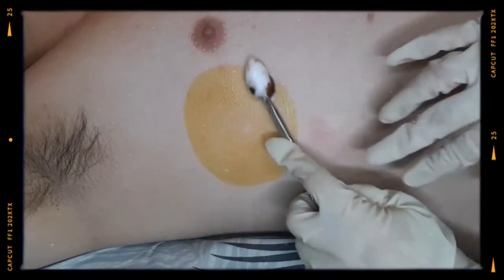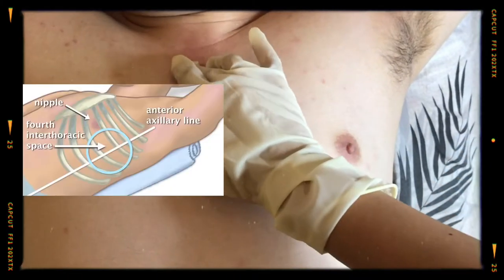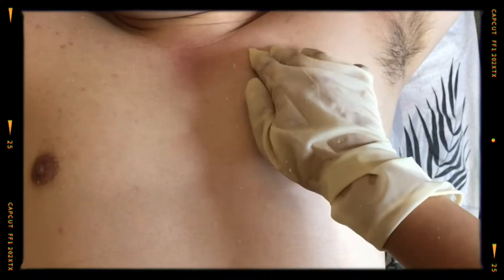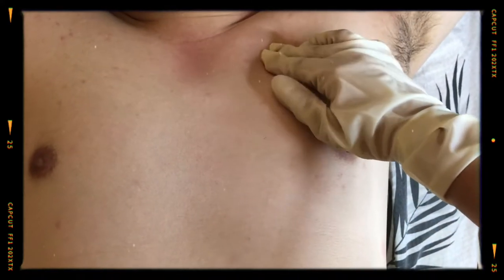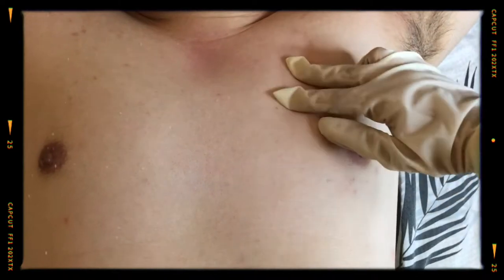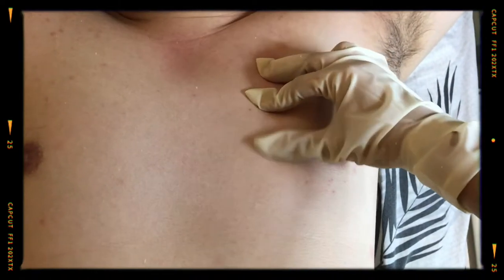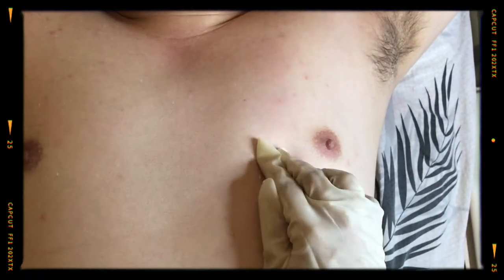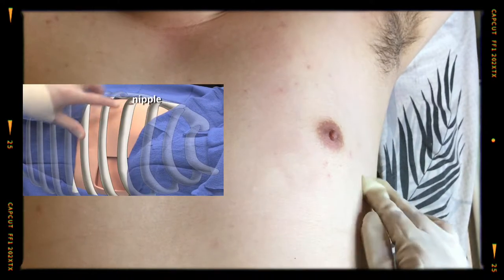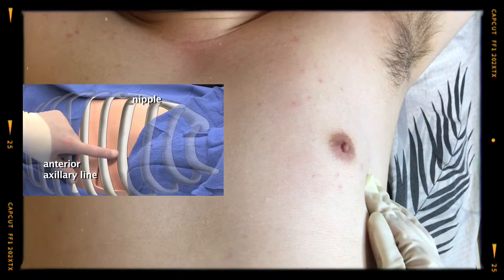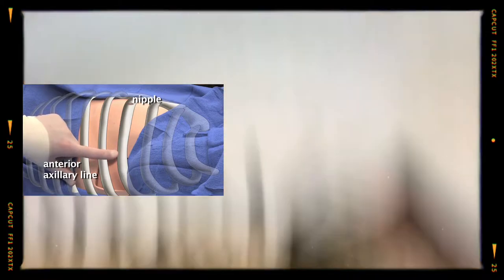Identify the fourth or fifth intercostal space at the anterior axillary line at the site of injury. We do this by identifying the sternal angle or manubriosternal joint, and the structure beside it is the second rib and second intercostal space. From this location, go down to the fourth and fifth intercostal space at the anterior axillary line.